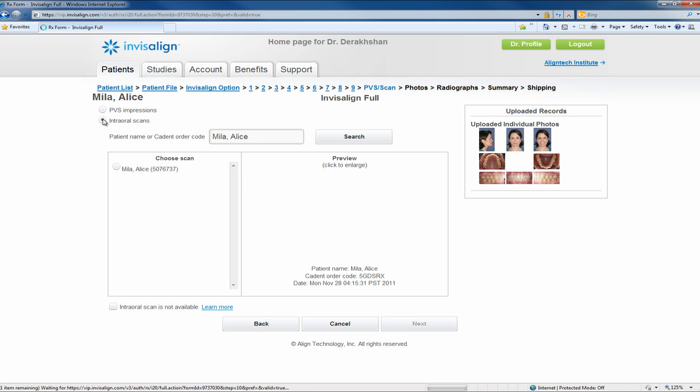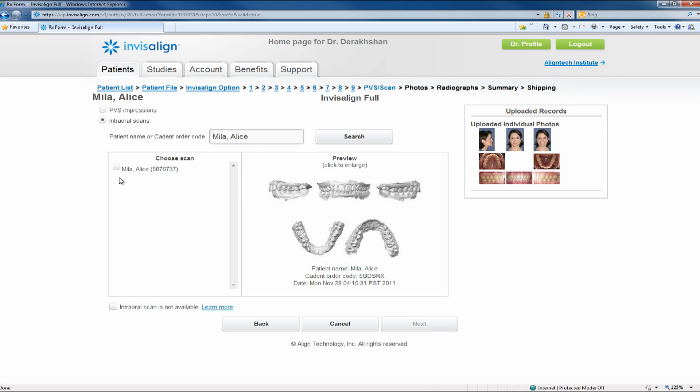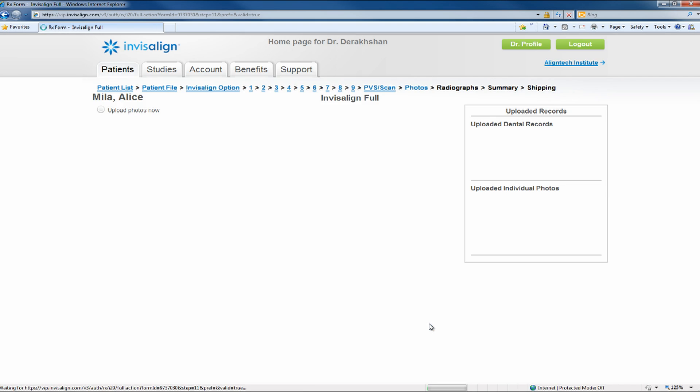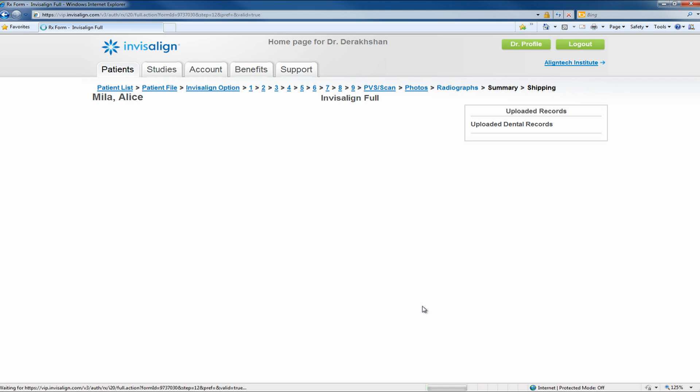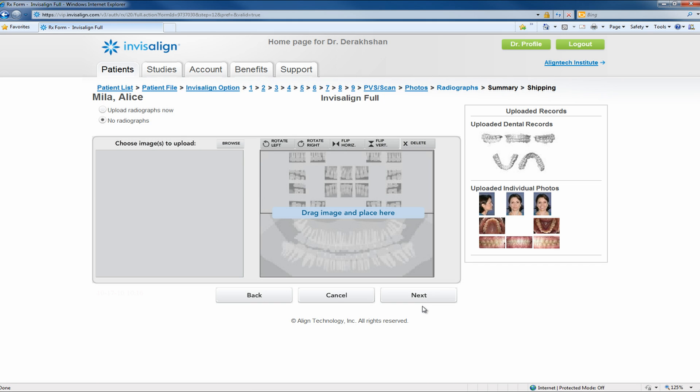After question 9, you will arrive at the PVS scan page, in which you will click on the intraoral scans option and choose your patient scan displayed on the left side of the table. After that, click next. The photos page will be pre-populated with your patient's pictures if you uploaded them when creating the patient; otherwise you will need to upload the pictures now. The last page is to upload radiographs, which is optional. After completing this page, the prescription form is finished.